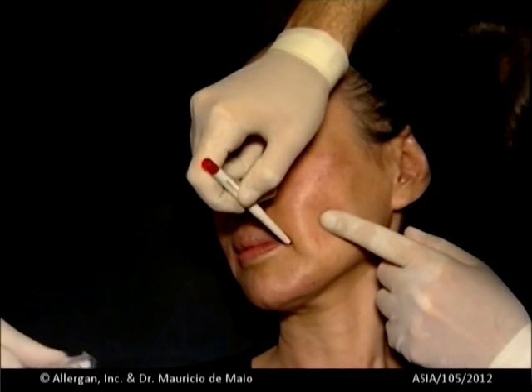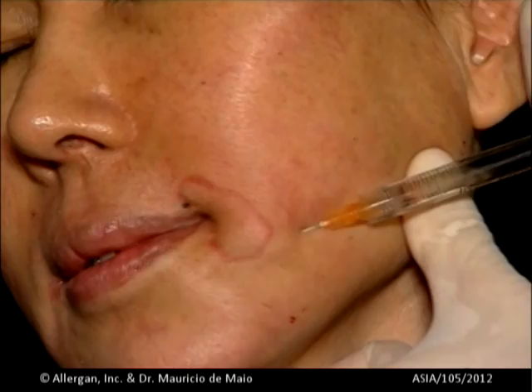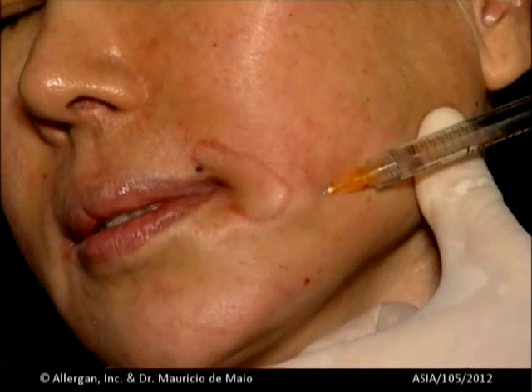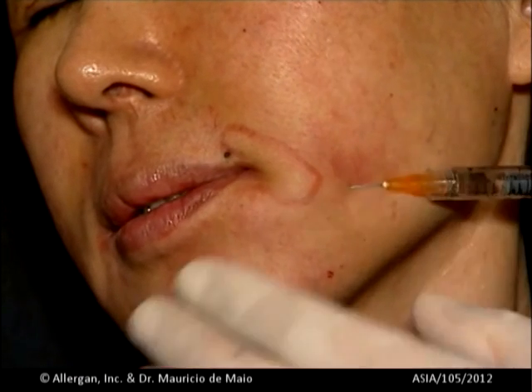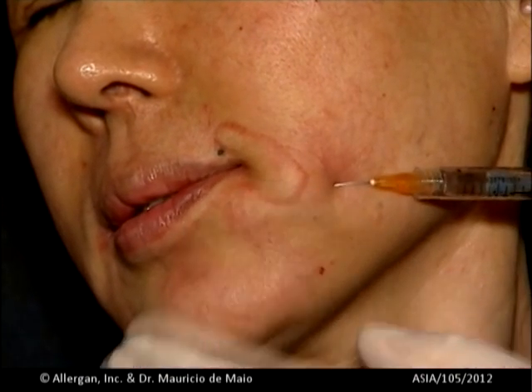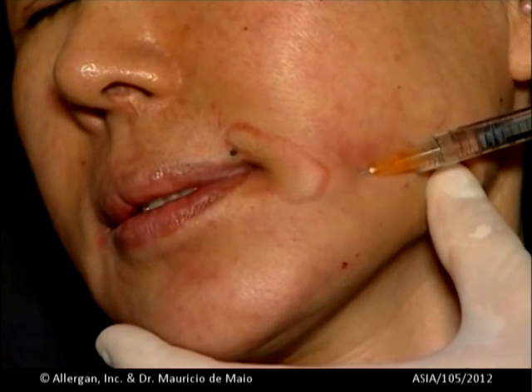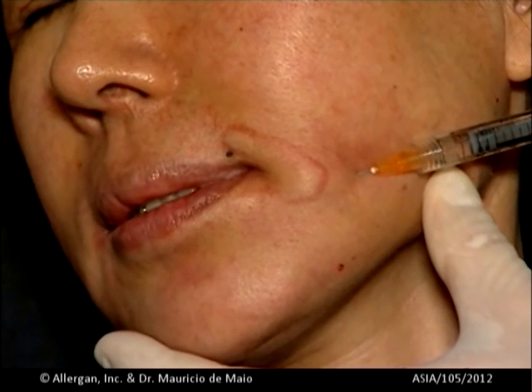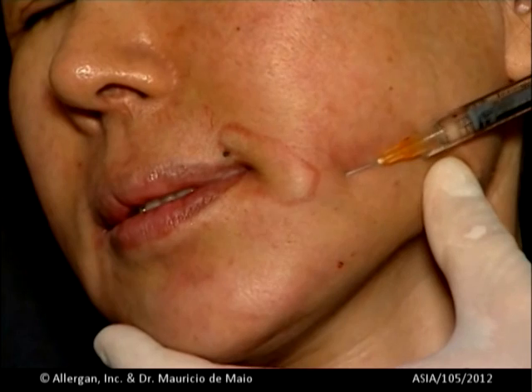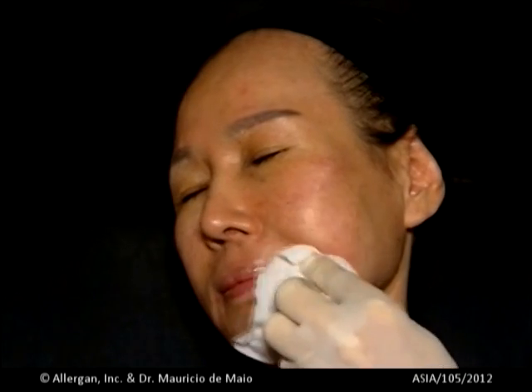Do the very same on the left side. Start by marking the no-go area. Inject Voluma with the 25 gauge cannula. Retrograde, anterograde to compensate the volume loss and the retruded lower maxilla. By replacing volume at this level, we get a better anterior projection.